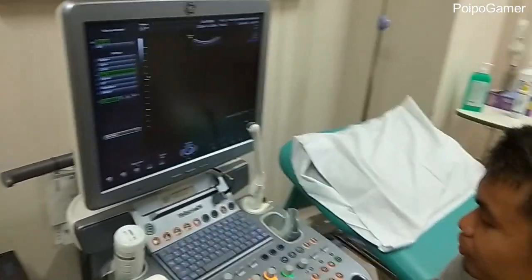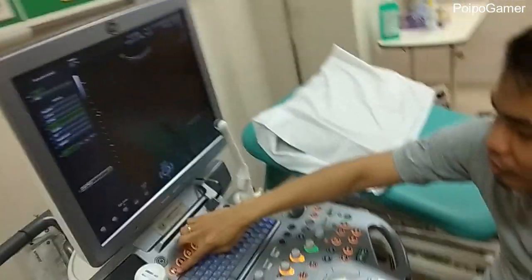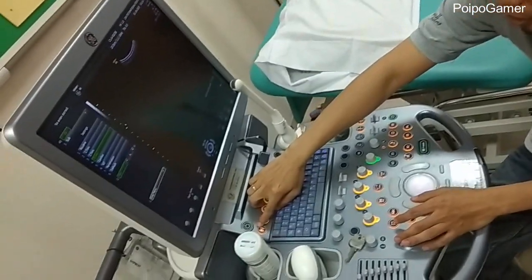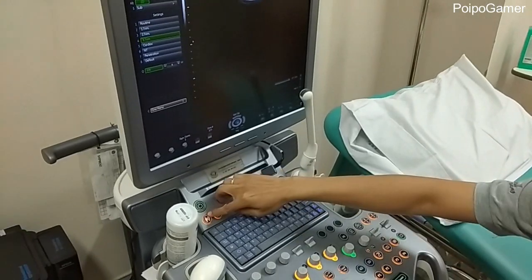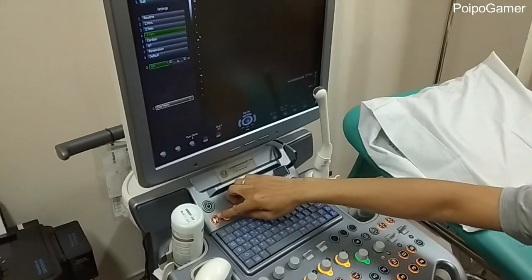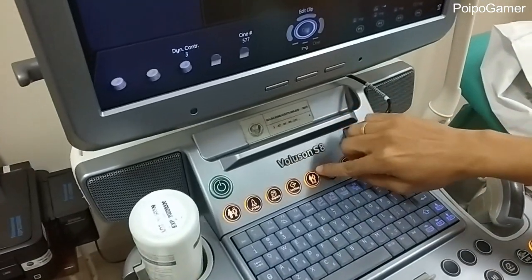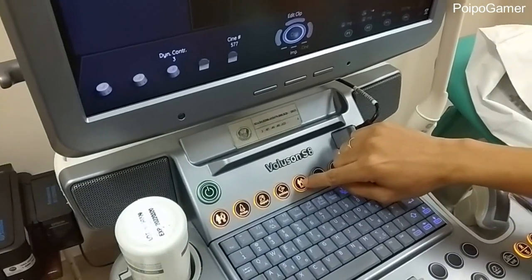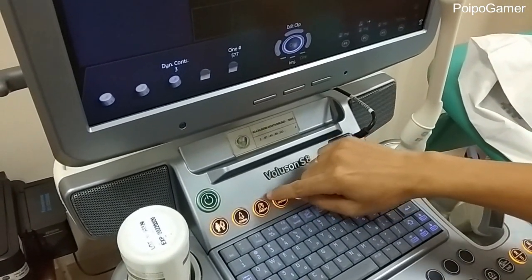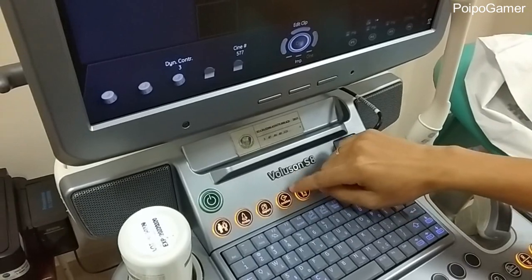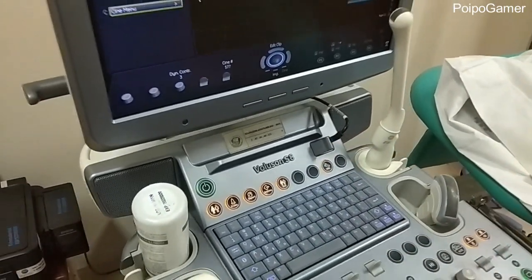So, first, when we want to create a new patient, we will click this button. This one means create new patient, and then if the examination is finished, then we click this end. And this is for creating a new report, and archive to see the old record from the patient.